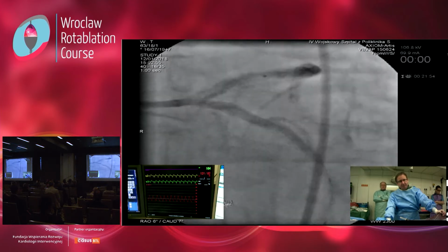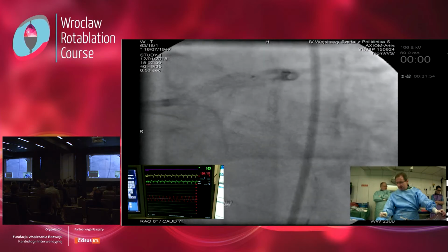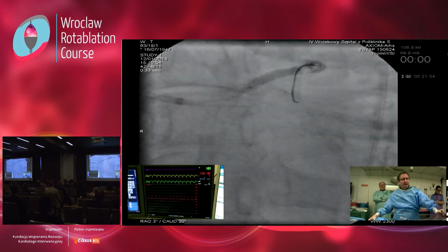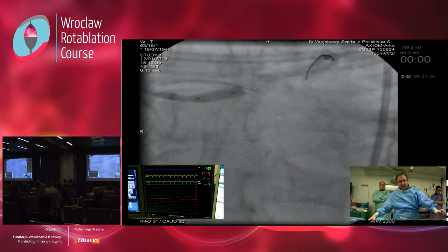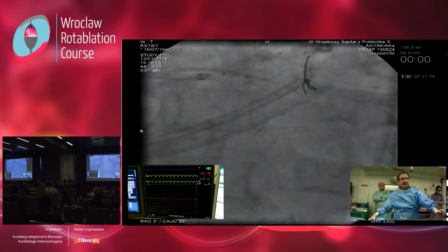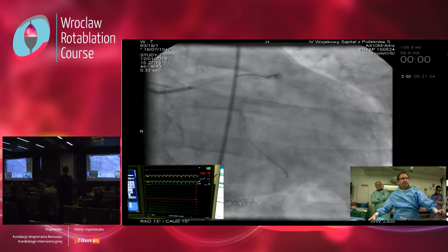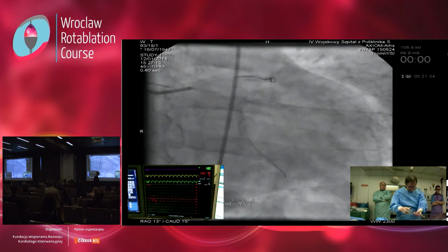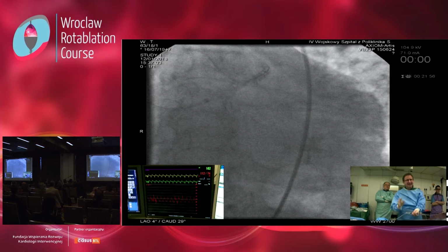And after post-dilatation POT, rewiring, then kissing. So this is post-dilatation, POT. Now kiss, can you see this? Yeah, we can see. Yes, yeah, we can see. Then kissing, and this is practically our final result.